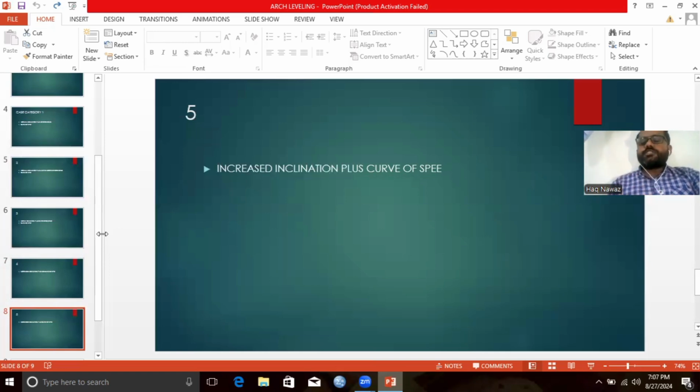So the vertical problem is double in magnitude. For these kinds of patients, we will start by extraction of first premolars. We will segmentally retract the canines using canine retractors, and we will align the incisors in a separate segment. The canines are first retracted segmentally using a canine retractor, T-loop or any canine retractor. Once they are retracted into the extraction space, we will connect the right and left sides of the arch by a continuous arch, which will bypass the incisors, similar to the mechanics that we used in our first category.